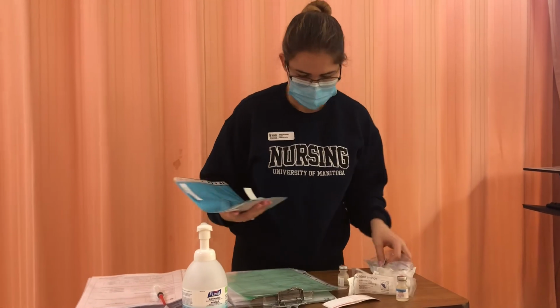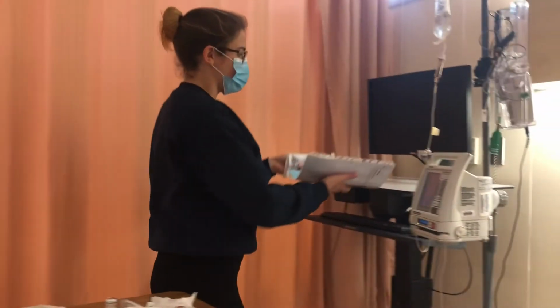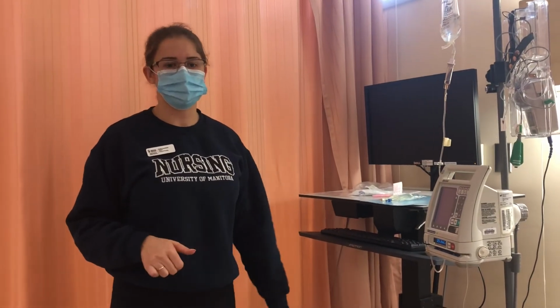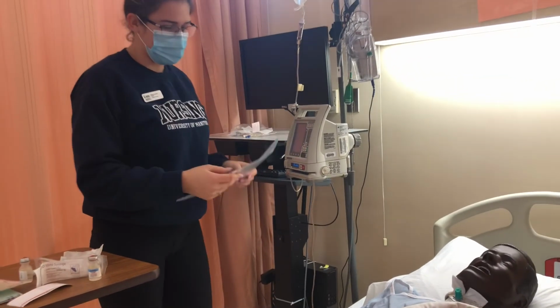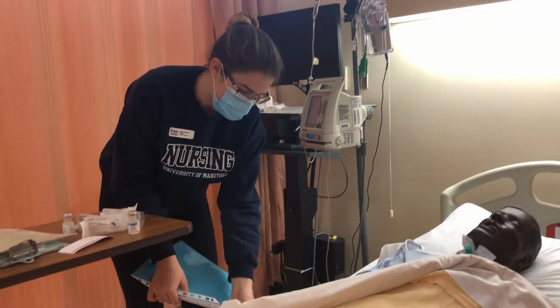Okay. So as I'm entering the patient's room, I'm performing hand hygiene. I'm doing my entrance safety check, making sure their bed's in the lowest position, the patient's not in any distress. I'm asking the patient's name. They tell me it's Emma Wrightson, and their date of birth, and they tell me it's the 20th of October, 1990. So I'm checking their wristband and comparing it to the MAR.